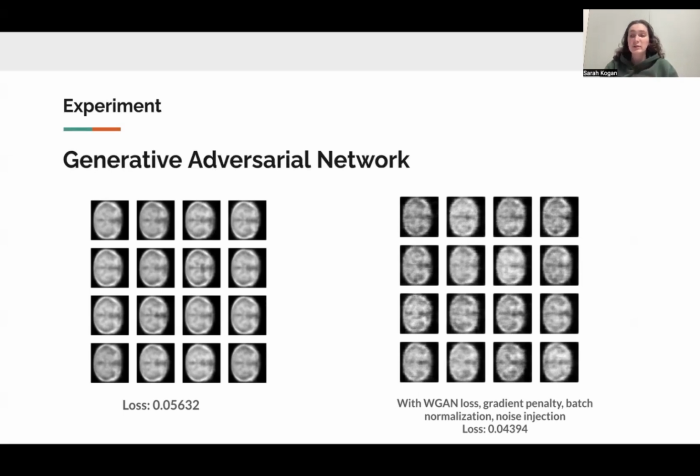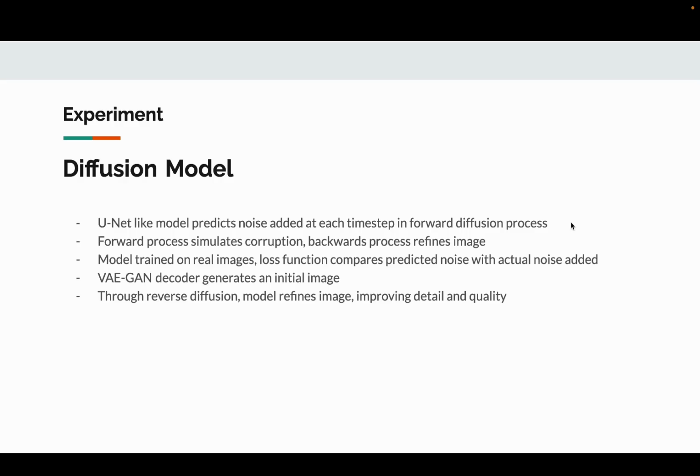This took us from the first image to the second, but did not lead to the level of improvement we were looking for, which is where the diffusion model comes in. We also wanted to add elements of diffusion models to our overall model because of their ability to progressively denoise the data. The core idea is essentially inspired by forward and backward processes.